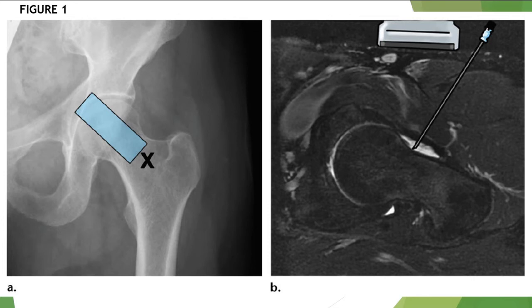So up there, just next to it, you have an image, which is an actual oblique MR arthrogram with an overlying drawing. So this is showing the ideal position of the transducer and the ideal access point for the needle. The needle approach, where you have reaching the deepest concavity of the anterior femoral head-neck junction.